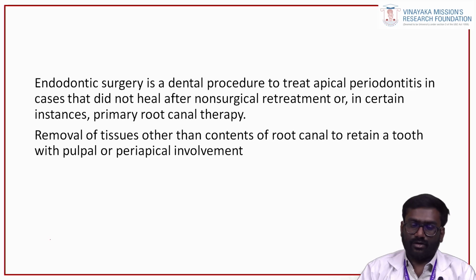That is called endodontic surgery, wherein we go surgically in the periapical region of that particular infected tooth and remove all the contents, like the granulation tissue and the granulomas that are formed at the periapical region, clean the pulpal chamber, and create a seal in the apex of the tooth. That is all about endodontic surgery. So today we'll see step by step how this procedure is done.